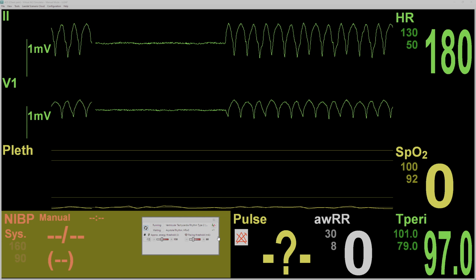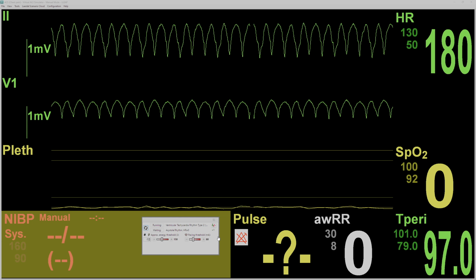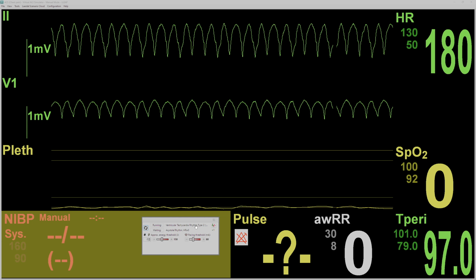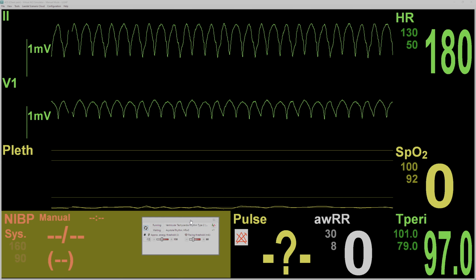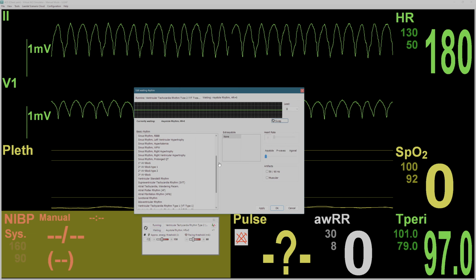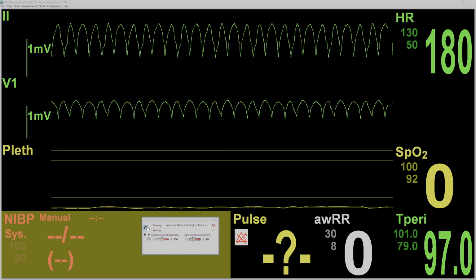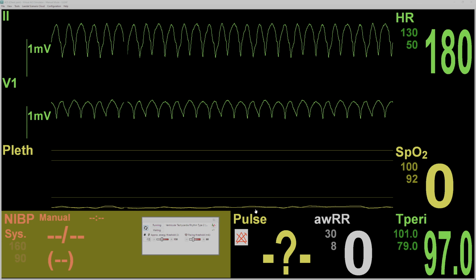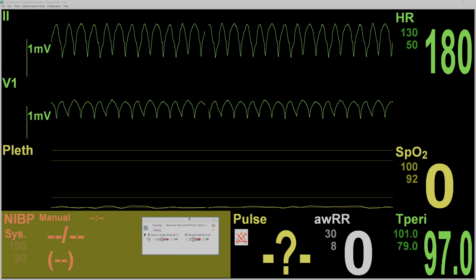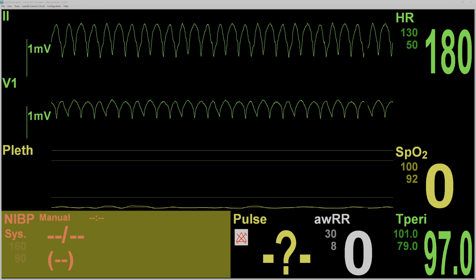They say, I don't feel a pulse, or I do feel a pulse. I say, you do not feel a pulse. They say, okay, I'm going to defibrillate at 200 joules, yada yada yada. I'm clear, you're clear, we're all clear. Shock, and continue CPR. All right, so then I'd go ahead and say, okay, this is the rhythm you're going to see until your next pulse rhythm check.